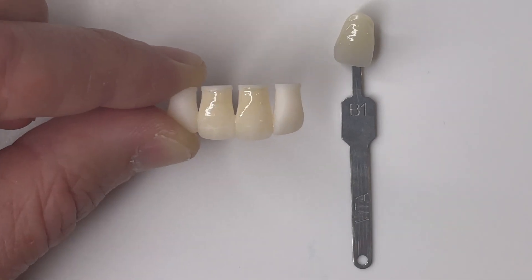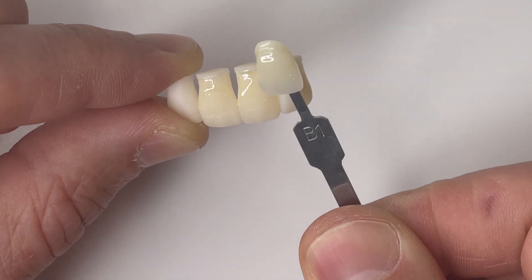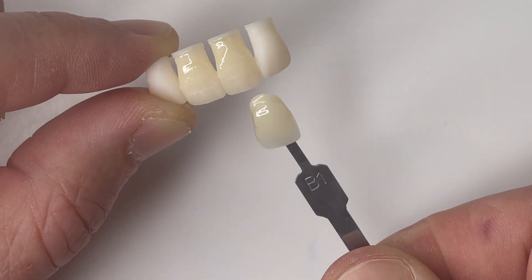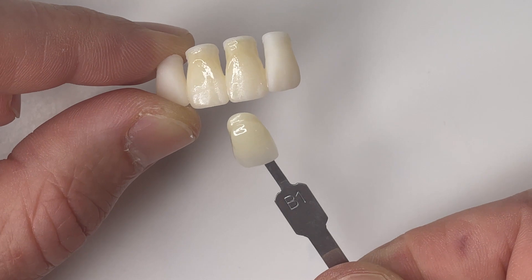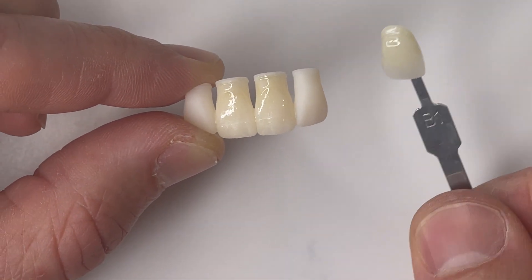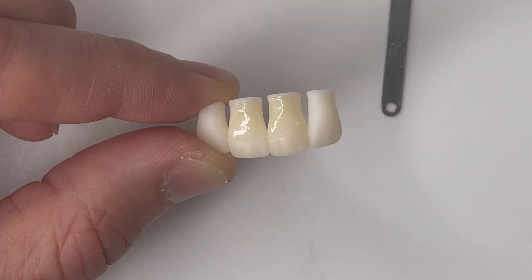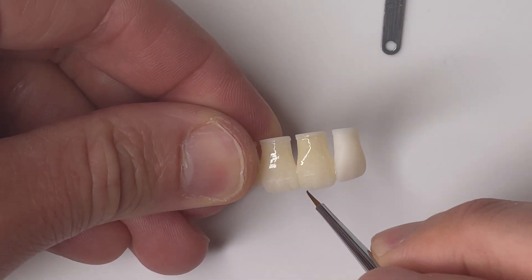Then it starts to give way to the appearance of translucency, which we're going to add in a moment. Looking at our shade tab you can see it did not take us long to get to that B1 and it looks really, really good. I'm going to leave those laterals unstained so you can keep in your memory where we started.